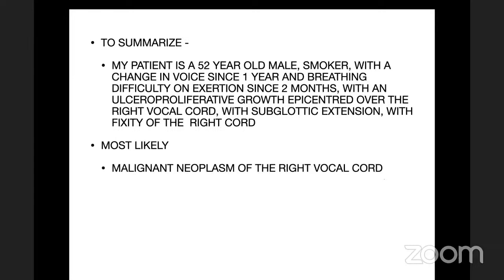Any tumor which crosses the ventricle is called a transglottic tumor, either upwards or downwards. She said something about subglottic spread, that's why I got a little troubled. Any tumor which crosses the ventricles from vocal cords to the supraglottis or from supraglottis to the vocal cords is called a transglottic tumor. That's it. So, no subglottic business. KK is a kind examiner.